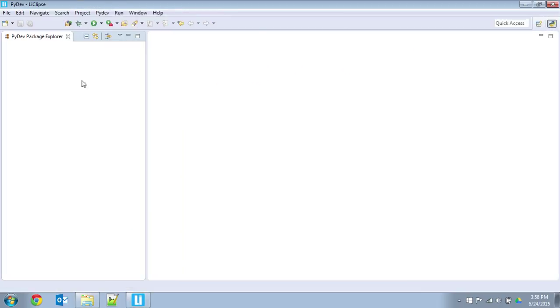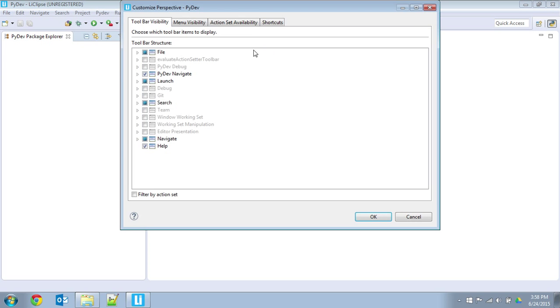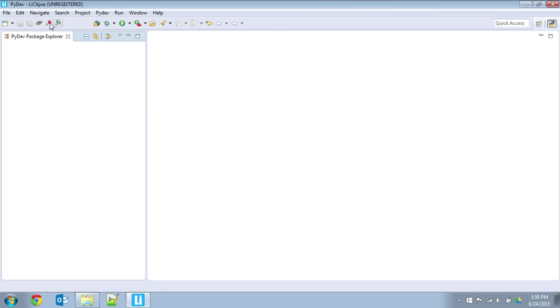Okay. So this is the default view from LiClipse. First we're going to set it up as per the instructions written by Andras Lasso of Queen's University. I'll add a link for that as well in the box. But first we go to Window, Perspective, Customize Perspective. In the action set availability, we enable the Python debug, specifically start and end server. Which brings these up, which is great.